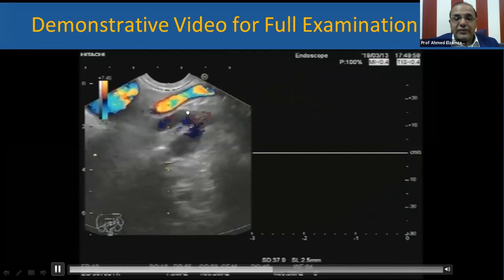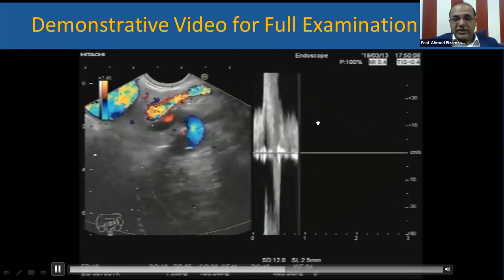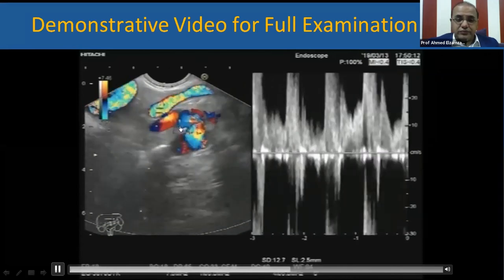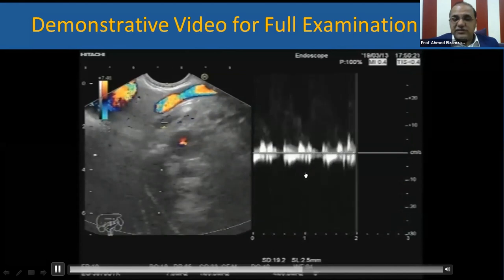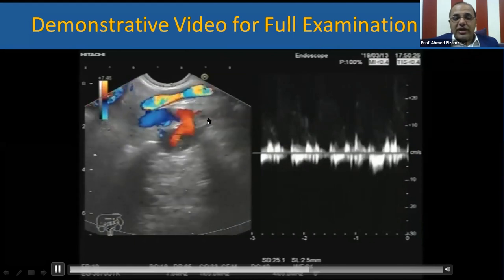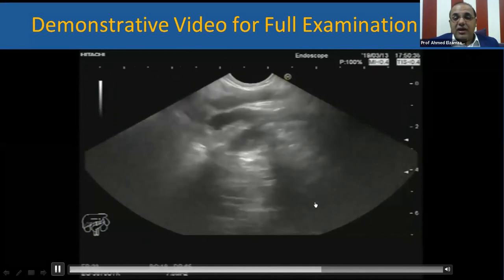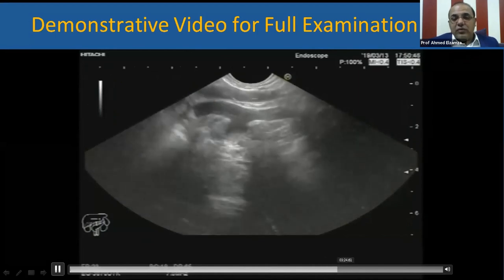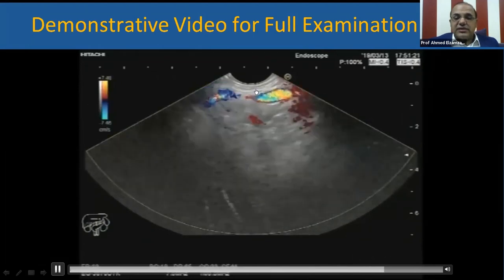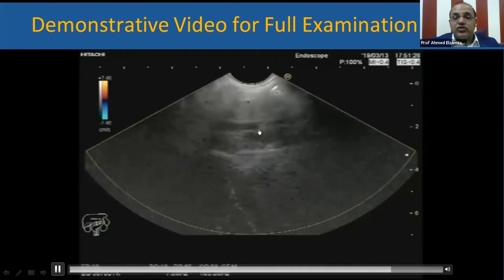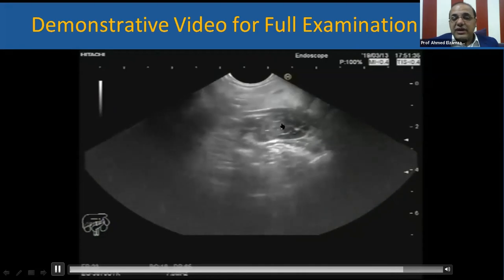This is the left common carotid artery. We use pulse wave Doppler to confirm the structure — this is arterial pulsation of the left common carotid artery. Then we apply Doppler for the venous confluence — this is venous pulsation — the left brachiocephalic vein formed by joining the left internal jugular vein with the left subclavian vein, and lymph node in front of them is lymph node station 3A. By further withdrawal of the scope, we find the root of the neck with the left lobe of the thyroid gland, sternomastoid muscle, and left common carotid artery. The lymph node in the root of the neck close to the left common carotid artery is lymph node station 1.